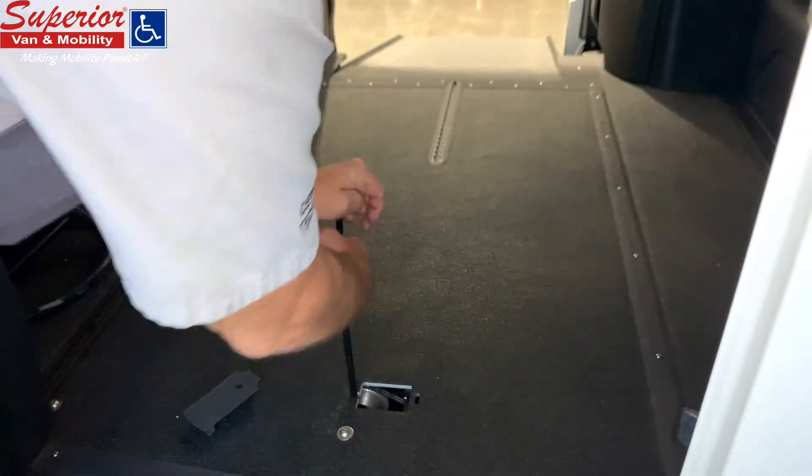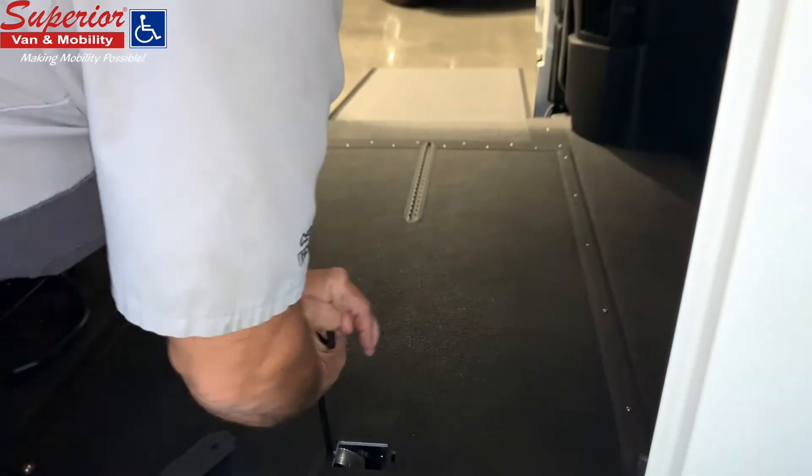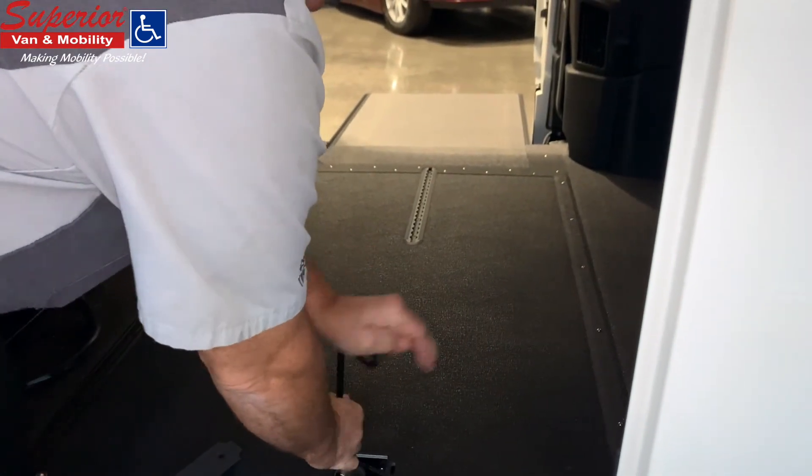This will then give you access to engage the gear and rotate one way to deploy and the other way to stow the ramp.